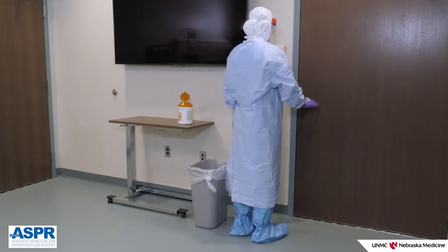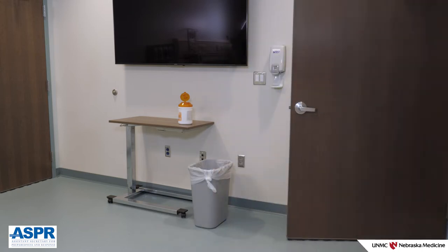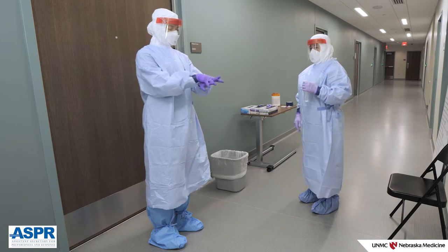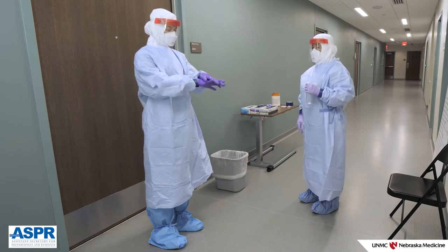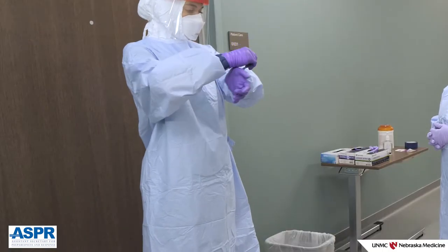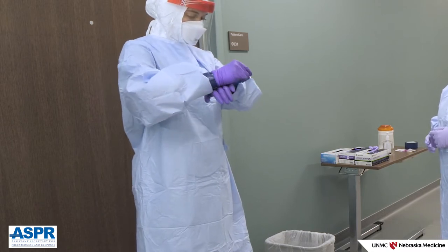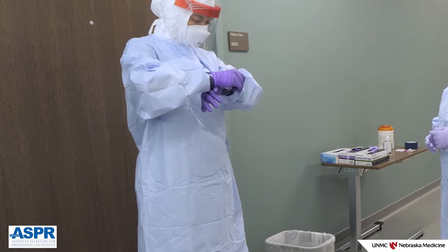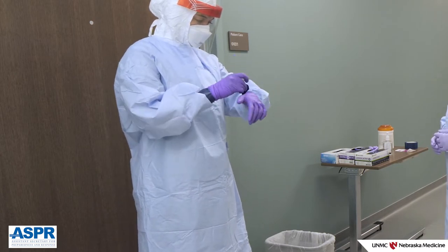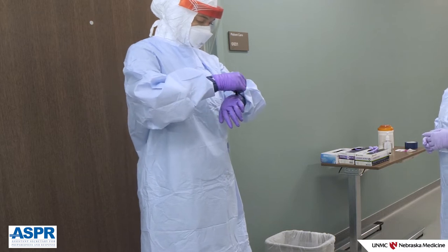Perform glove hygiene on the long cuff gloves, rubbing all surfaces until dry. Knock on the door to alert the doffing partner you are ready to exit the room. Open the door and exit the room. Step forward from the door into the doffing space and perform glove hygiene. Carefully remove the tape from both arms. Roll the tape up prior to putting it into the waste container so as not to allow the adhesive side to stick to the bag lining the waste container. If any tape was used for reinforcement of the gown, it should be removed at this point.